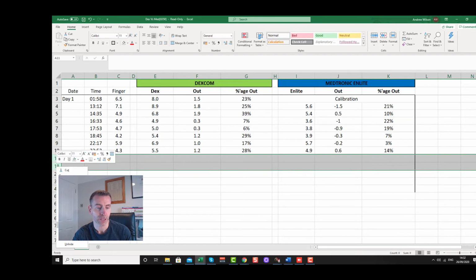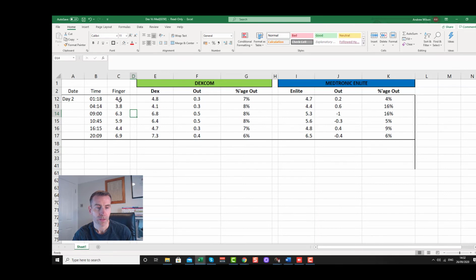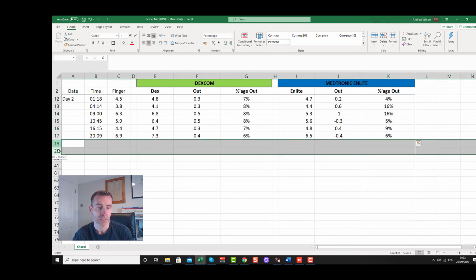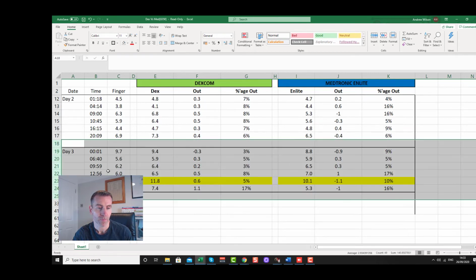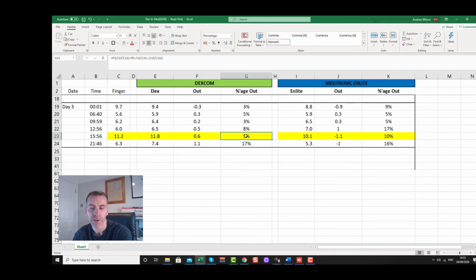If we look at day two, okay, there's only 6 that were taken, but look at the percentages. So much better than day one, aren't they? Much, much better. Day 3. And this was the interesting reading. Had a high blood glucose on day 3, halfway through the day. And you could see that the Dexcom was only 5% out, but the Medtronic Enlite sensor was 10% out.